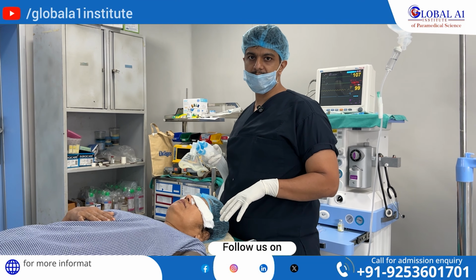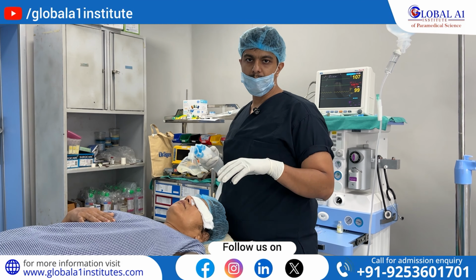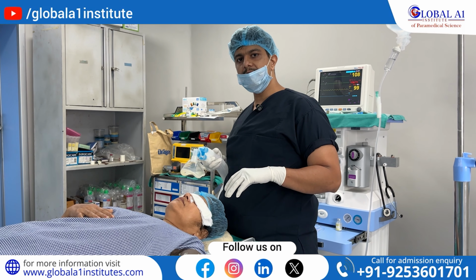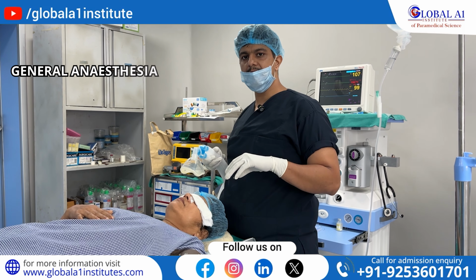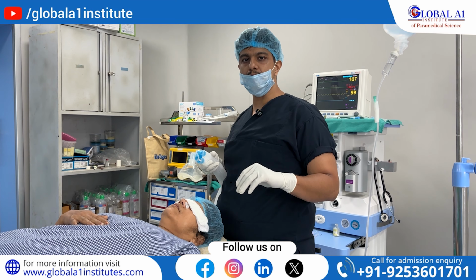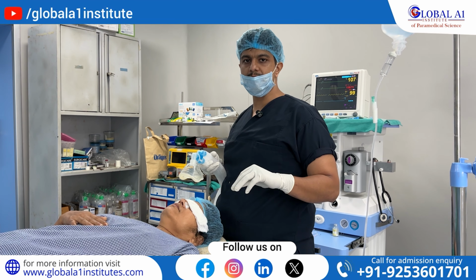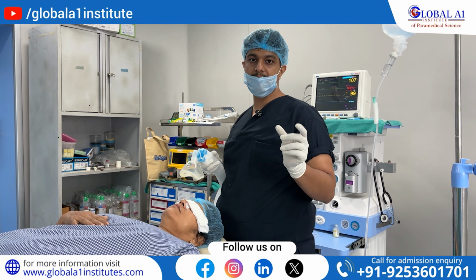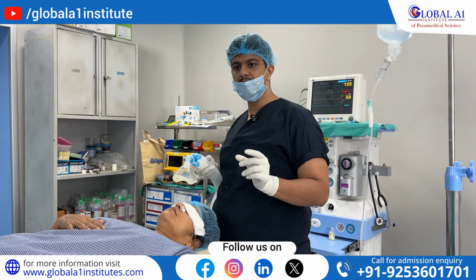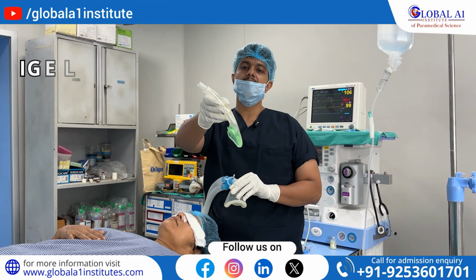In this case, she is a patient posted for elective surgery of right side clavicle fracture. We are giving her general anesthesia. We'll be maintaining the airway either with the supraglottic device. It is called SGD. There are different types of SGDs. There are second gen, third gen. So today we are using an iGel.